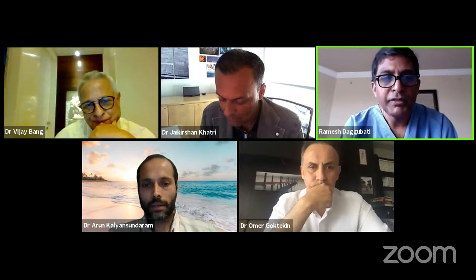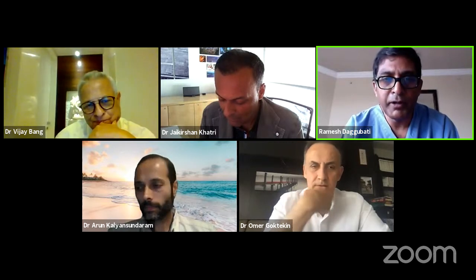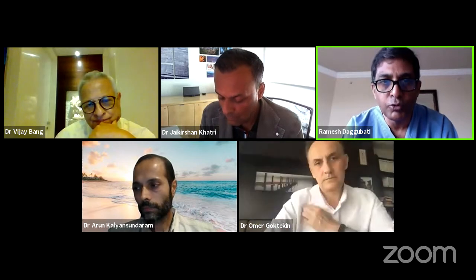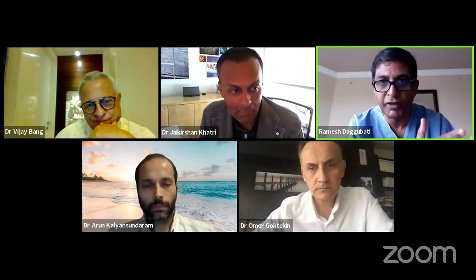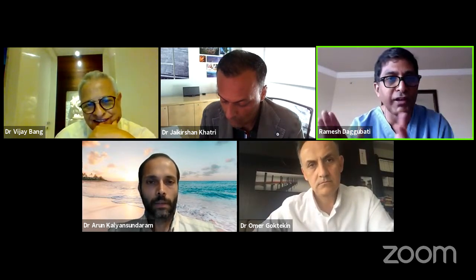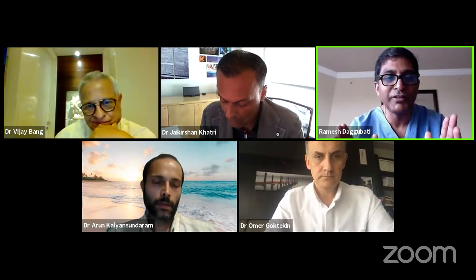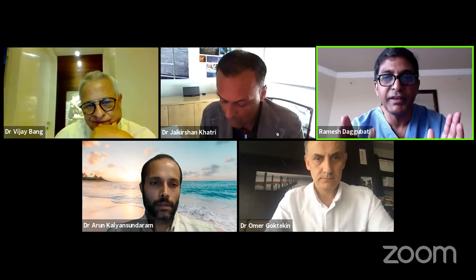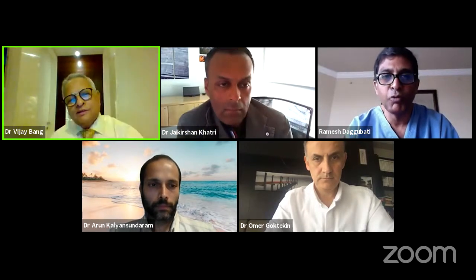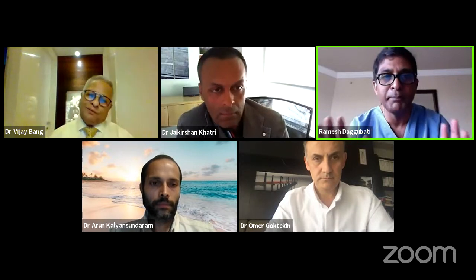I'm on call. So Impella or mechanical circulatory support in CTO, I think it should not be the go-to. It should not be the first option. If the guy is requiring it for an elective, I'm talking about, as what Jay said, for cardiogenic shock, obviously cardiogenic shock is separate. But do not fall into the category that every CTO needs an Impella. We should not be the ones who are. We are not salesmen for any company.